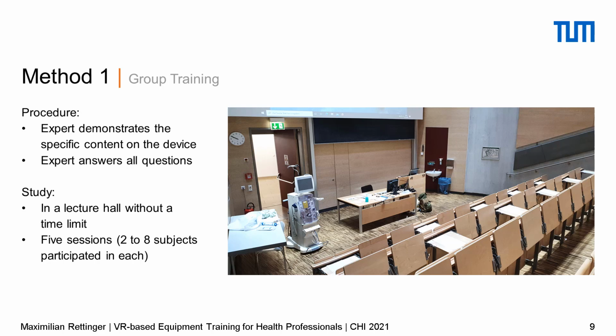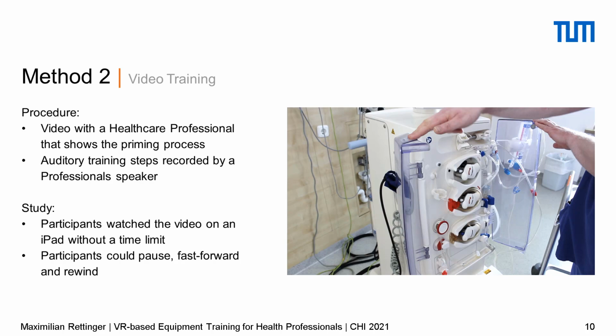For the video training, we recorded a medical expert who shows the priming procedure. Also, voice recordings for each step were created by a professional voice actor and integrated into the video. During the study, subjects watched the video on an iPad and were allowed to pause, fast forward, or rewind the video. There was no time limit.